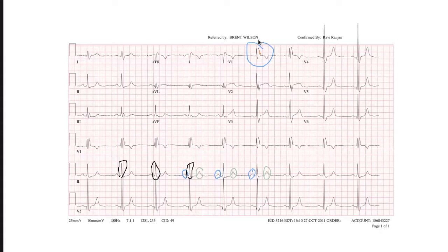Why is the T negative on that? T waves are a weird phenomenon. Don't even look at it. Because some other stuff has happened, the ventricles are activating somewhat out of order, and it's going to change how the T wave looks in possibly difficult to predict ways. But the QRS is giving the clearest indication of what's going on here.